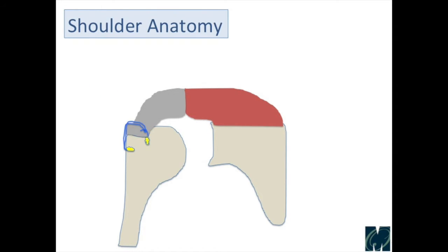We take those sutures that we've tied down on that medial row — that first anchor — and we pass them around and put them into a second anchor laterally, which is off the edge. By tightening that down into the second anchor, it brings down the entire tendon. That other edge that was sticking up is now pushed down and we've repaired it. This causes the tendon to heal back to the bone, and we get compression into the bony surface to allow for healing.